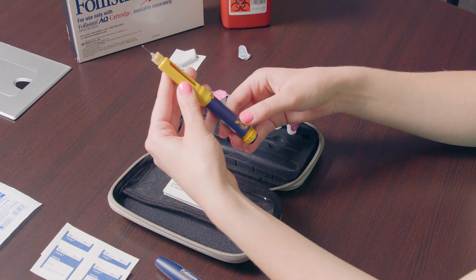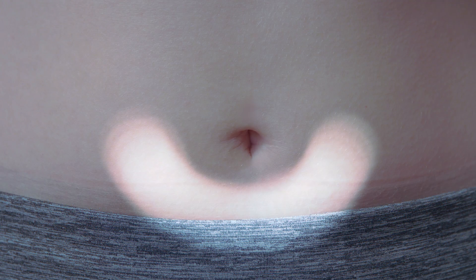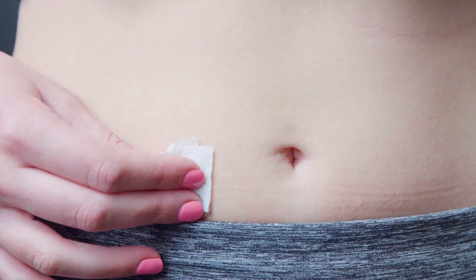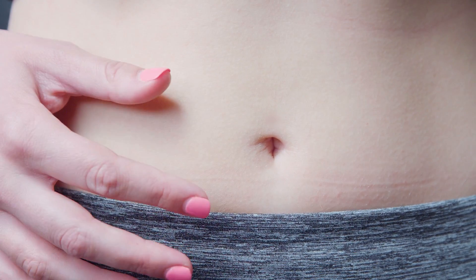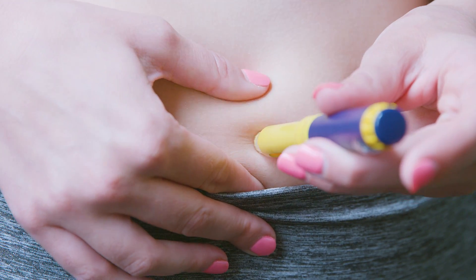Once the correct dosage is reached on the pen, it is time to prepare the injection site. The injection site will be a subcutaneous location that has been specified by your physician. The most convenient site for a subcutaneous injection is in the abdomen around the navel. Make sure to switch sides of the injection site after each injection to help reduce injection site reactions and bruising. Disinfect the injection site with an alcohol swab and allow it to dry.